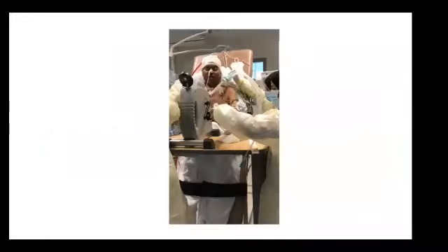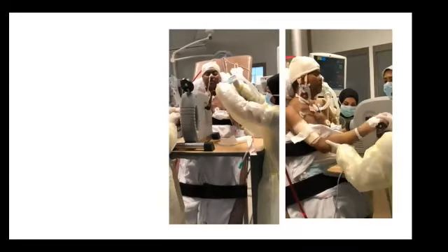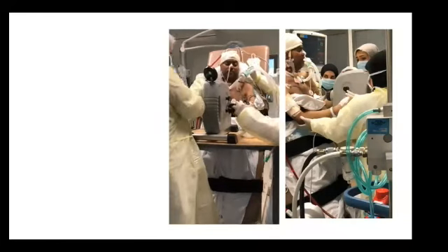Some patients will get stuck at the edge of the bed, and we cannot progress due to weakness. So we will choose a tilting table, because a tilting table can give me weight bearing exercise, and I can do so many things on it. I can work with head control, trunk control. I can give upper limb exercises. I can loosen the straps and work with other muscles.